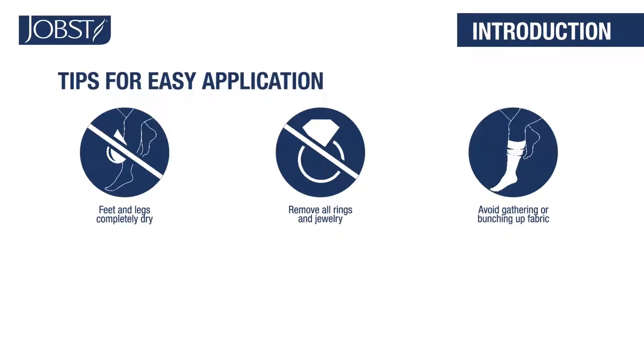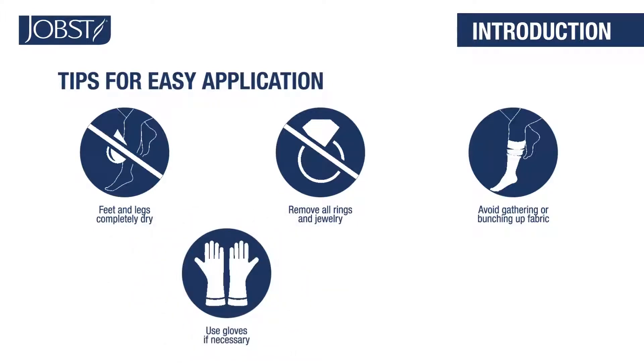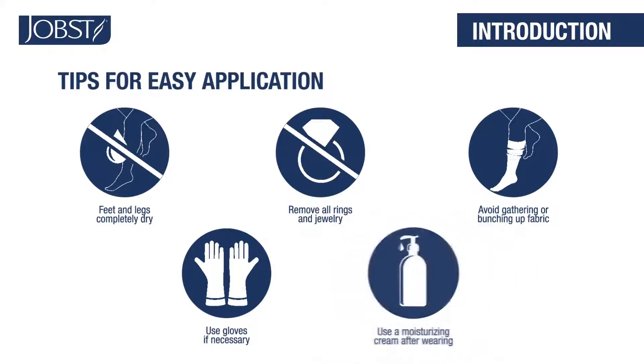It's difficult to slip your foot through the narrow opening. If you prefer, you can use gloves to help create friction and provide a better grip. Use a moisturizing cream after you take off your Jopest hosiery to keep skin moisturized and healthy.